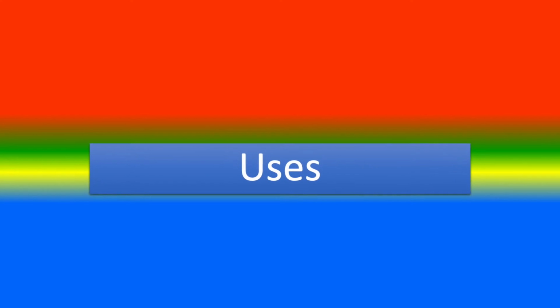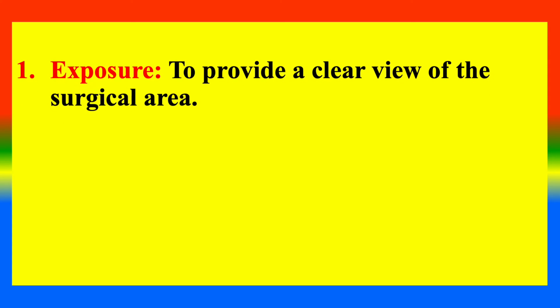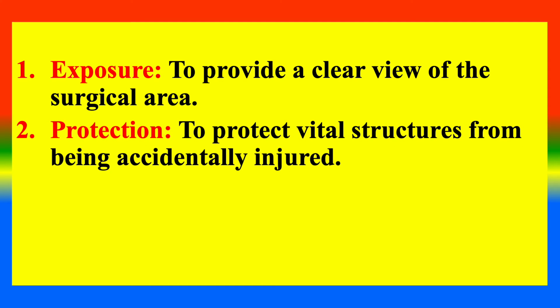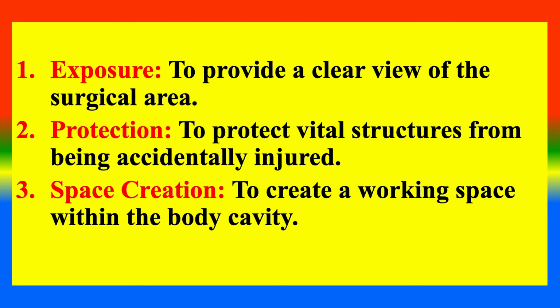Uses of retractors. First use, exposure, to provide a clear view of the surgical area. 2. Protection, to protect vital structures from being accidentally injured. 3. Space creation, to create a working space within the body cavity.